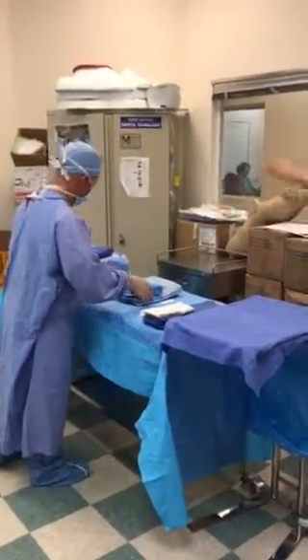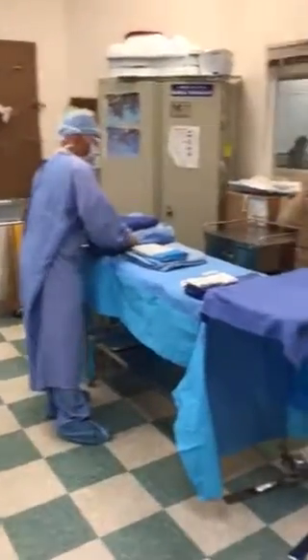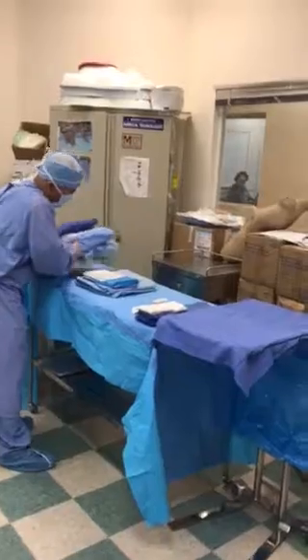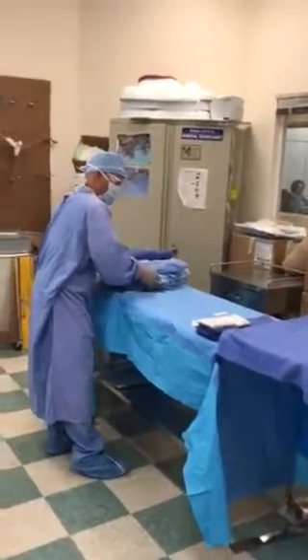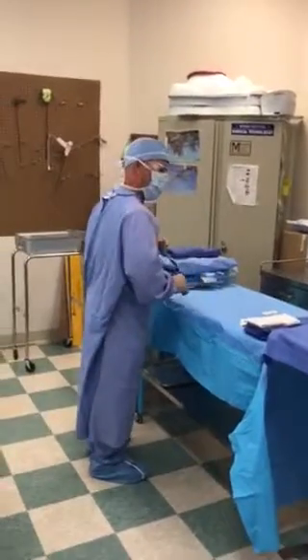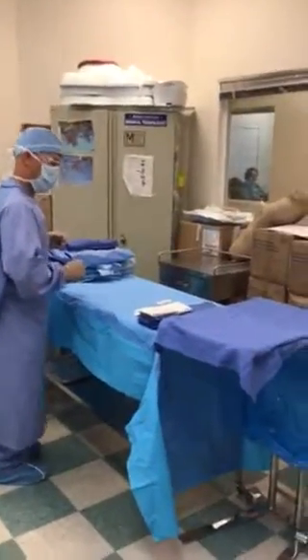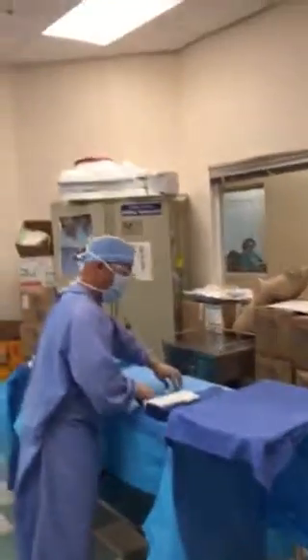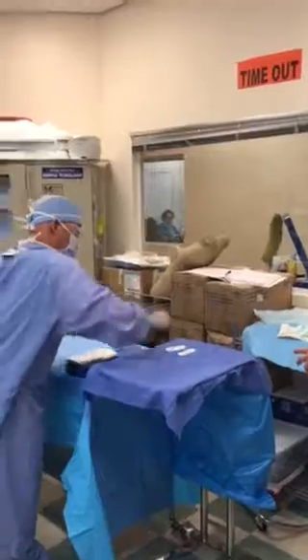Put it underneath your lap all the way because we don't need any of that. Now you can put your sutures up here for now just to get them out of the way, and then put your towels on your back table so you can dress your back table with your towels and have space.